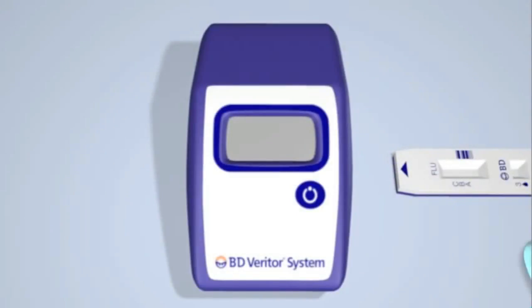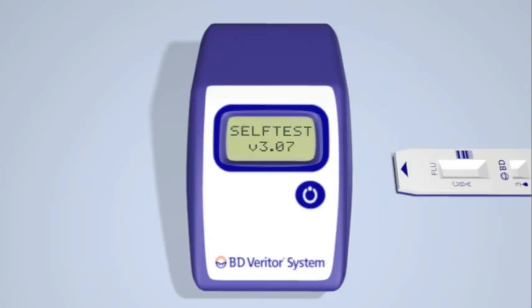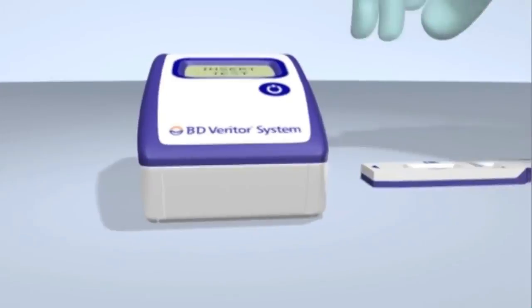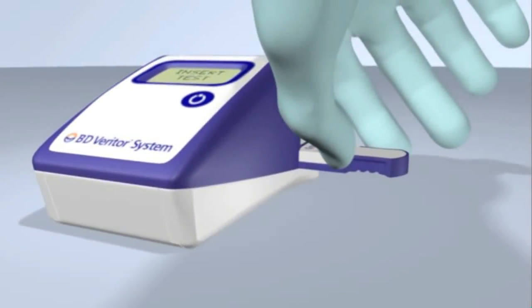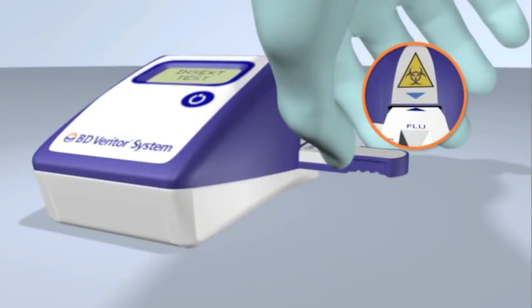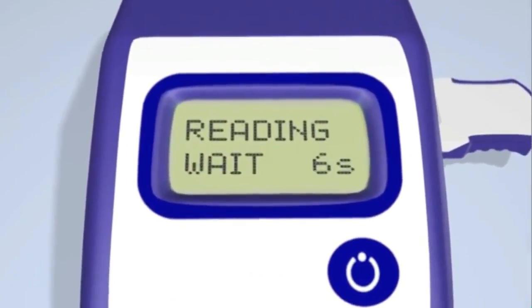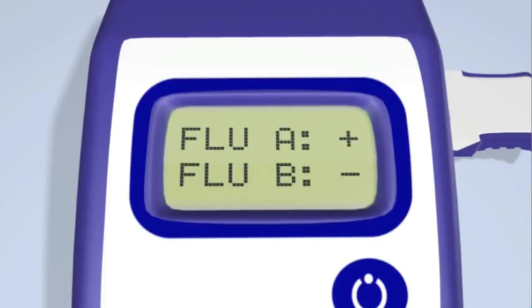After the test has run for 10 minutes, power on the BD Veritor System reader. Immediately after powering on, the reader will perform a self-check to verify its operation. When prompted, insert the Flu A plus B test device into the slot on the right side of the reader. The system's unique keyed feature assures that the test device can only be inserted the correct way. Follow the easy-to-read prompts displayed on the reader screen to complete the procedure and obtain your test result.